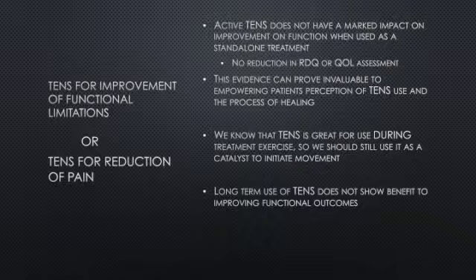And also, we know that TENS is good for use, actually great for use during exercise, but should we still use it as a catalyst to initiate movement when that patient's pretty motivated to get going and get after it in their own treatment plan? Also, long-term use of TENS doesn't show any benefit in improving overall functional outcomes. So if you have that patient, the only way you can get them up and exercising is on the TENS unit, maybe you should start thinking of some other ways that you can incorporate other pain blocking mechanisms or other activities that will distract that patient from the pain so they don't become dependent on the actual TENS unit.